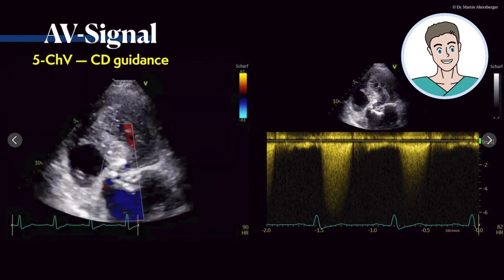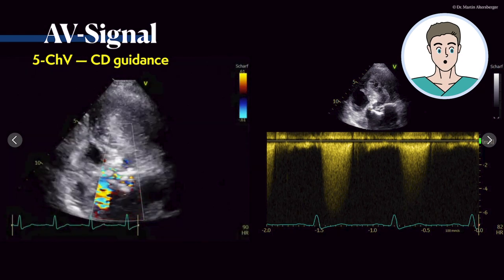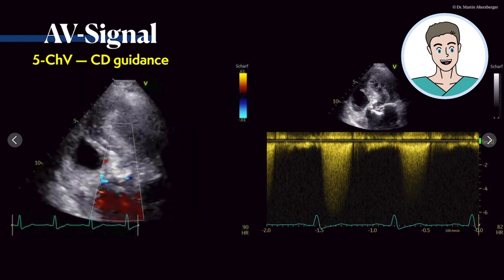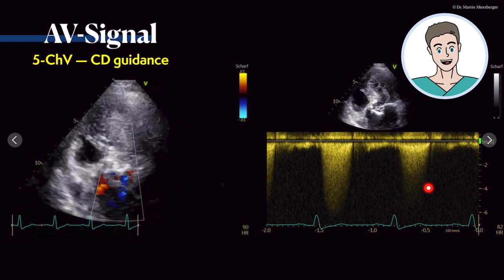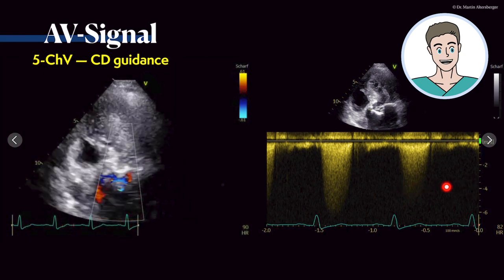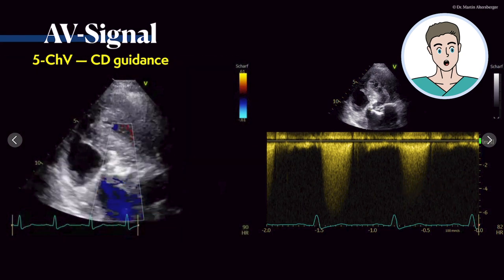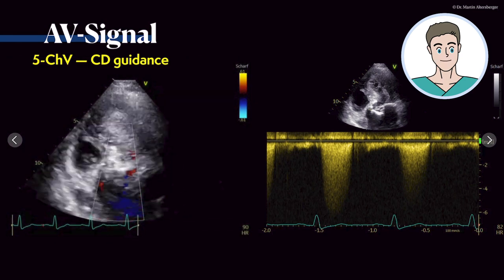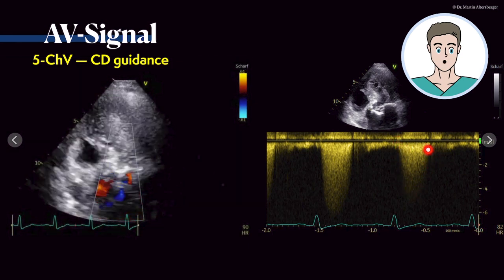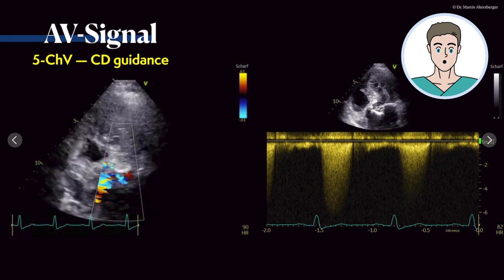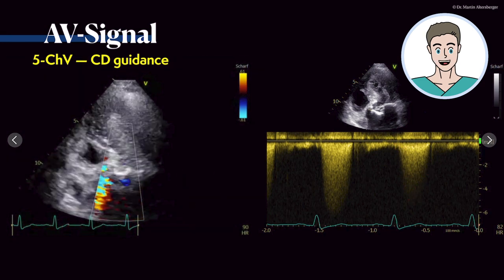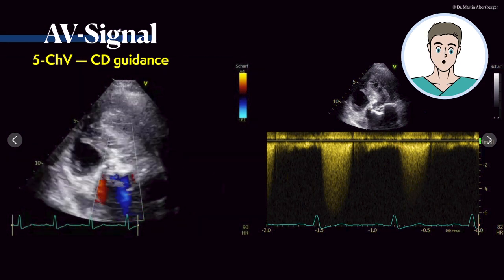If you do not have the optimal signal, it looks entirely different — you have a less strong signal and it by far doesn't reach six meters. Still in this case it would be around four meters per second, so probably still a severe aortic stenosis. If you do not have the optimal angle or position of the continuous wave Doppler, you will miss a lot of information. So always try to optimize the image.